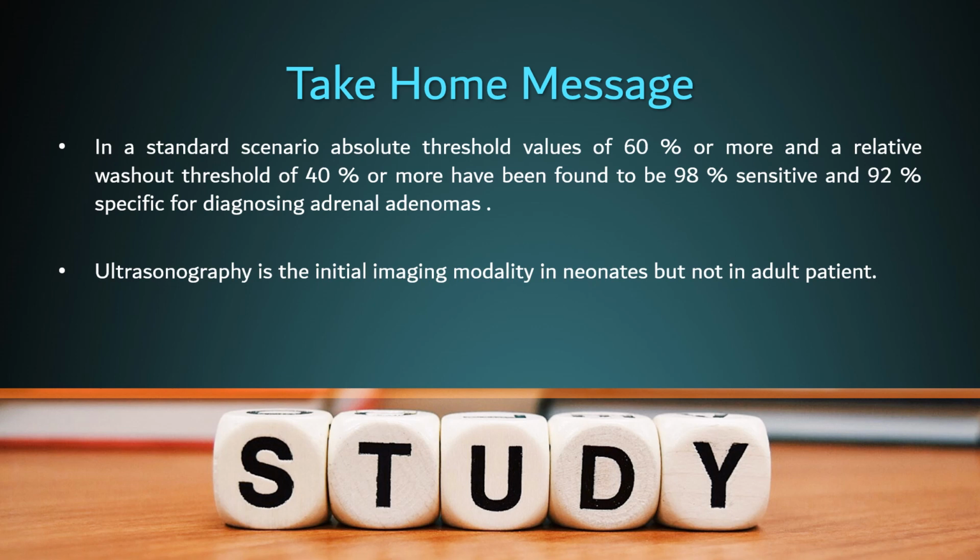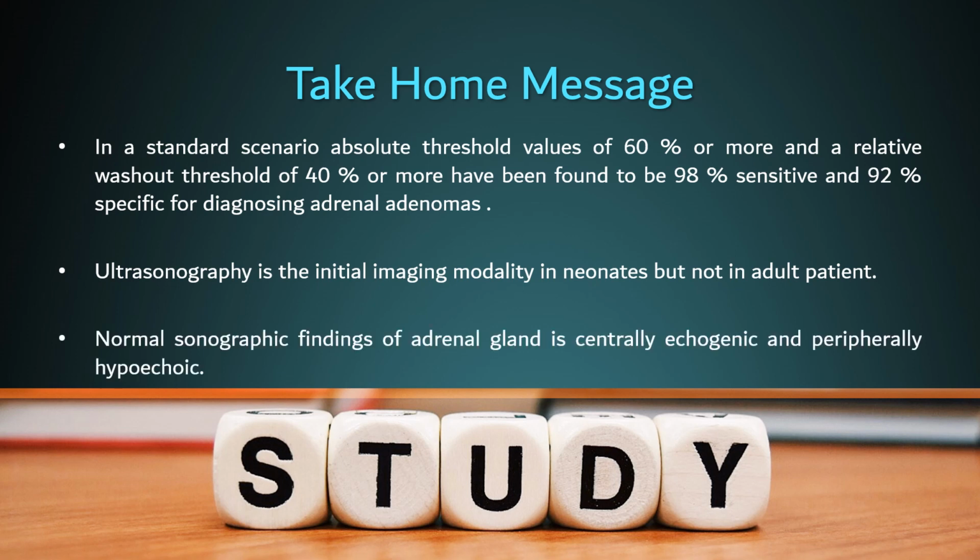Remember also, ultrasonography is the initial imaging modality in neonates but not in adult patients. The normal sonographic findings of adrenal gland is centrally echogenic and peripherally hypoechoic.